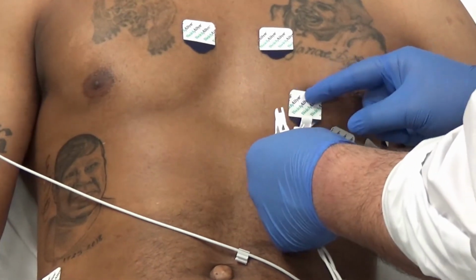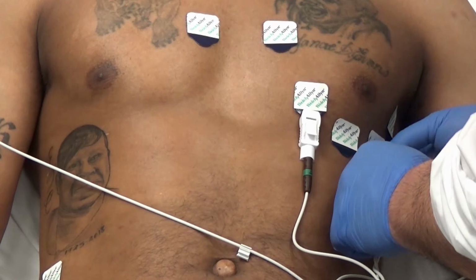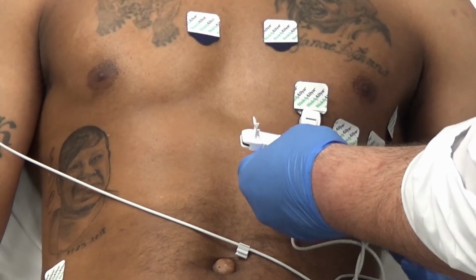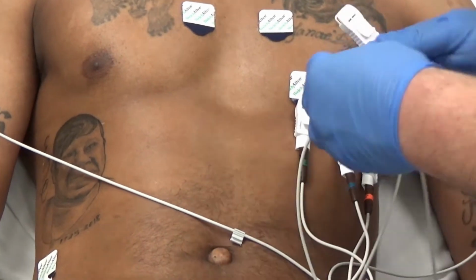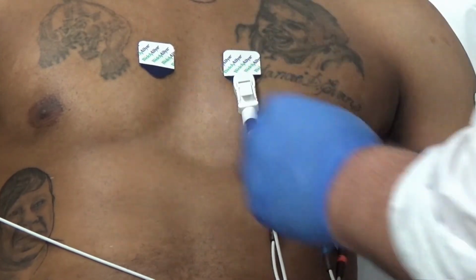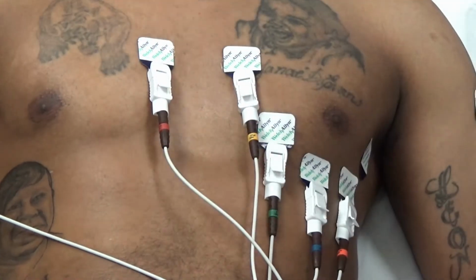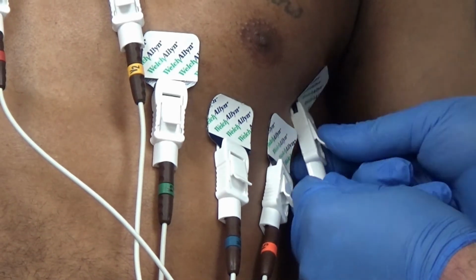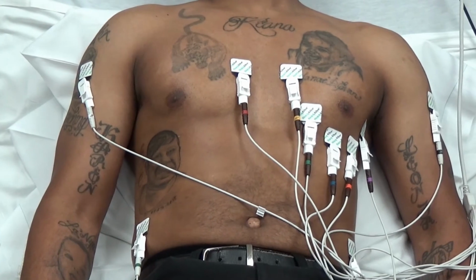And I'm just going to put them on in the order I grab them. So there's your V3, this is your V5, your V4, your V2, your V1, and our V6 right there. So now we're all hooked up with our 12 lead EKG.